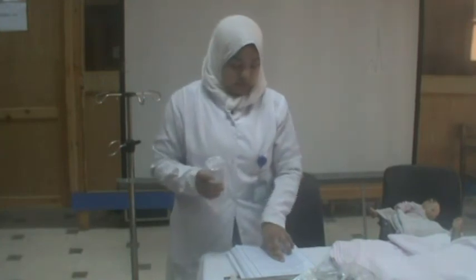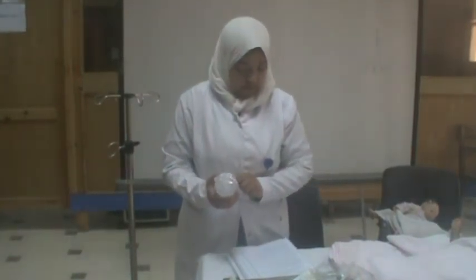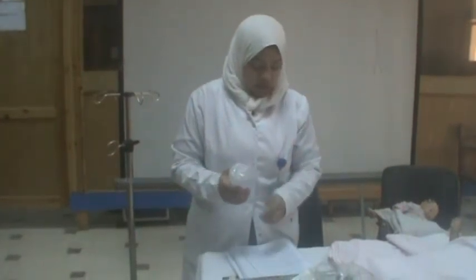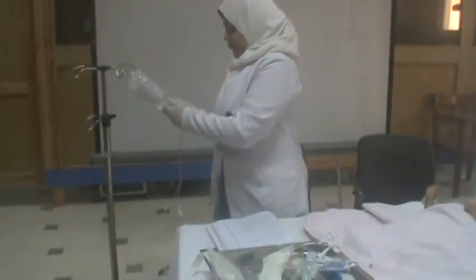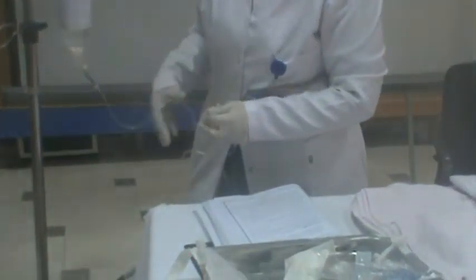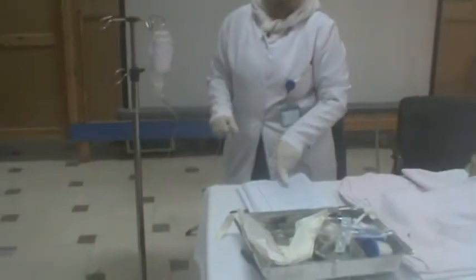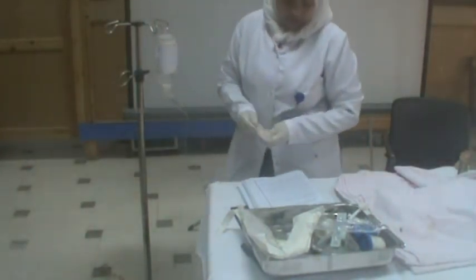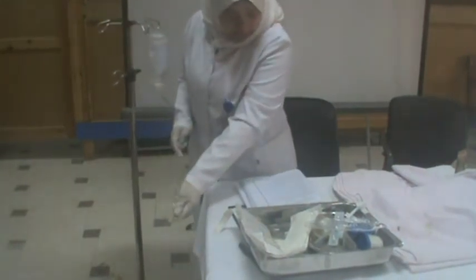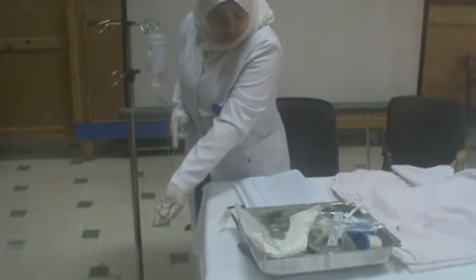Write the date on the label including room number, child's name, components, start time, and drip rate, then place the label on the bottle. Remove the protective cap from the spike of the infusion set and insert it through the outlet port of the bottle. Squeeze the chamber and fill it one-third to one-half with solution to prevent air bubbles from entering the tubing.